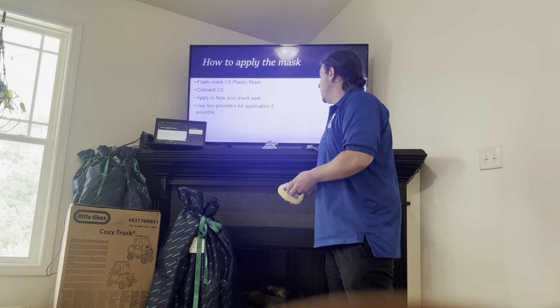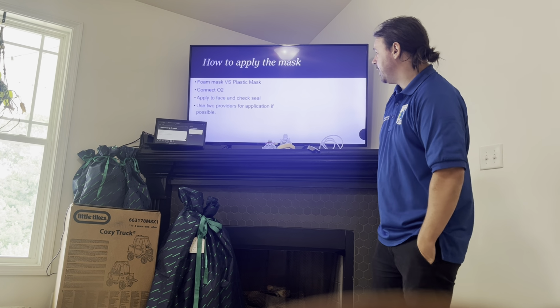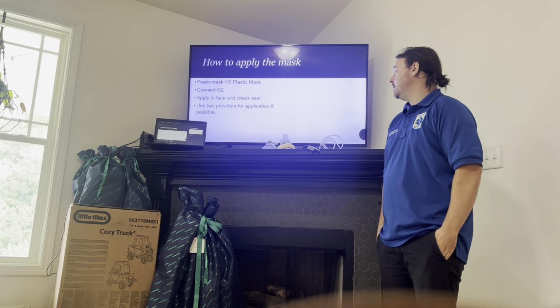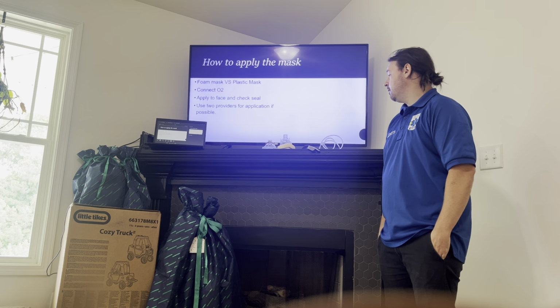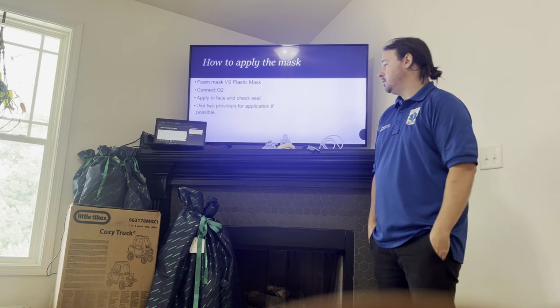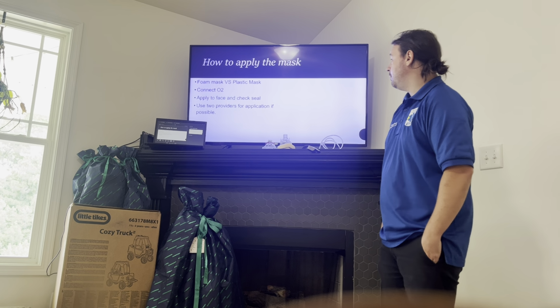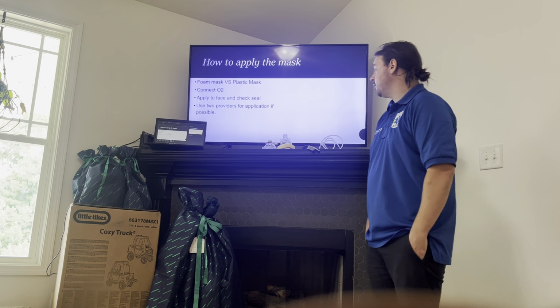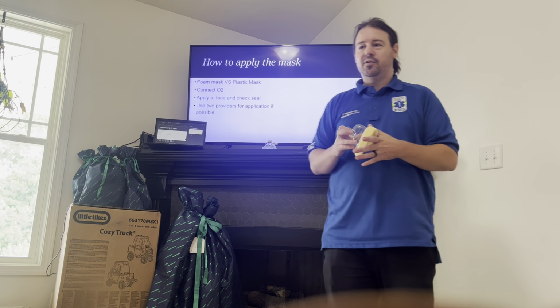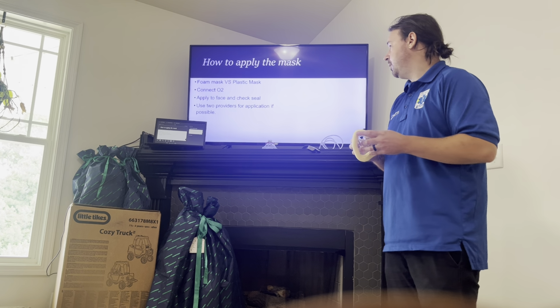Go ahead and make sure that you connect the oxygen. Once you connect it, just make sure that the oxygen is running. You do not need to necessarily set your pressure just yet, because the pressure that you are going to be using may change as you place it on the face. But we do need to make sure that oxygen is going through the mask. Apply the mask to the face. We'll do this shortly with a real patient so we can get some hands-on experience.